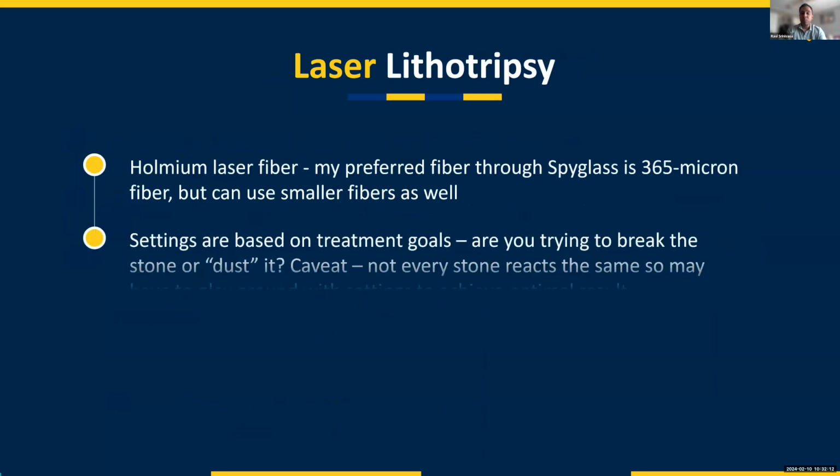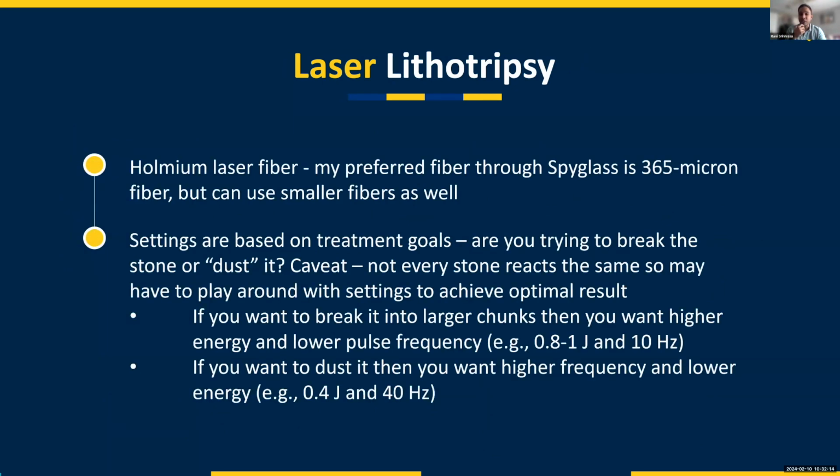We use a variety of methods for energy to treat stones and also to treat strictures. I typically use laser. EHL is probably the most commonly used method, and it's really easy to set up, and it comes with the system. It essentially uses a high voltage spark to cause energy to be transmitted into the stone and break it up, and you have a couple of different settings that you can use to break a stone or crack a stone.